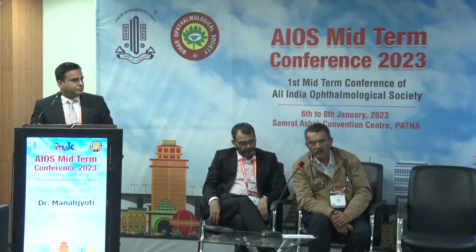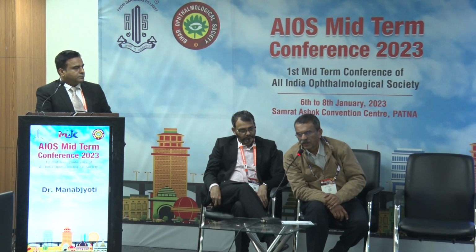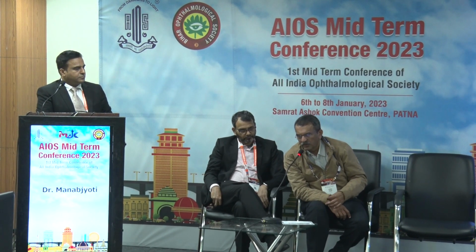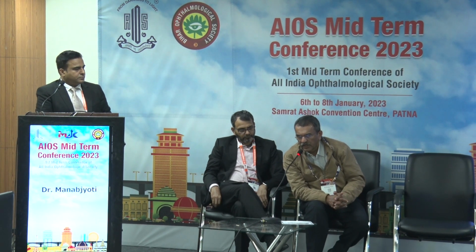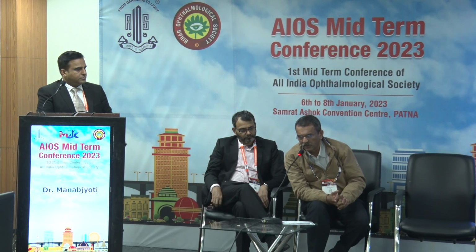So, sir, is it possible that we don't go for an FFA and directly go for an OCTA, and then on that we treat the patient and follow up the patient? Yes, that's how the spectrum is moving. Maybe today we take OCT, FFA, and OCTA because our experience with OCTA is very limited. But down the line, we might come across a situation when all macular diseases will be managed only with OCT and OCTA and not FFA.